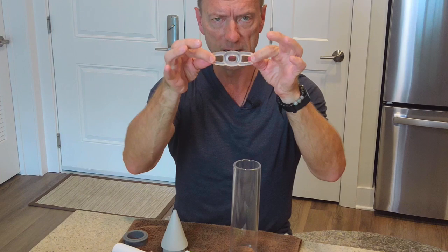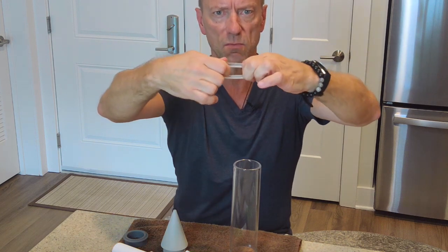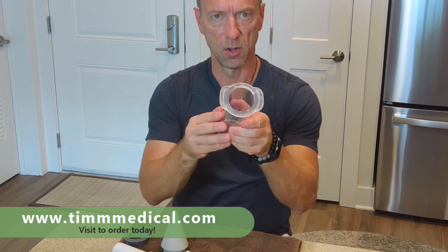Rather than pull out here on these two outer rings, get inside on the middle here and really just pull it out and create that large opening, and then just straddle the cylinder just like that. And you see I've got it loaded here.